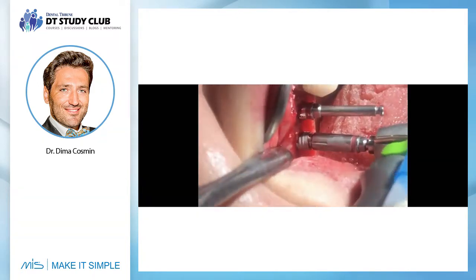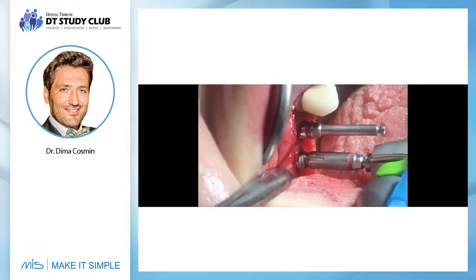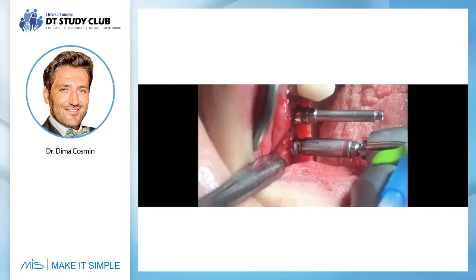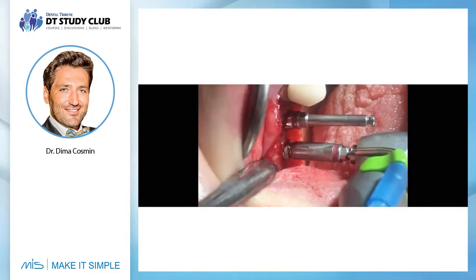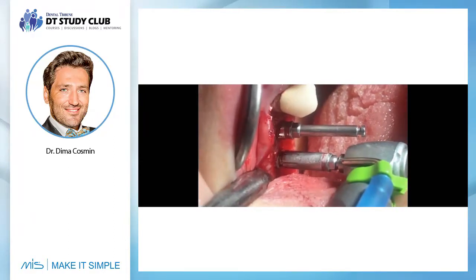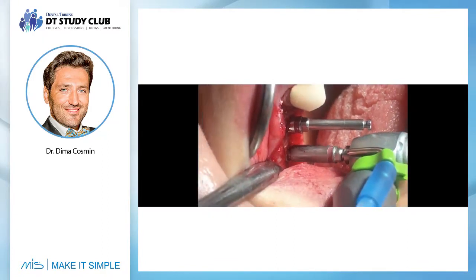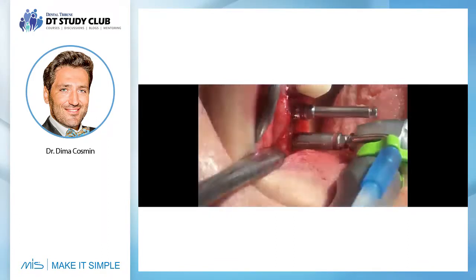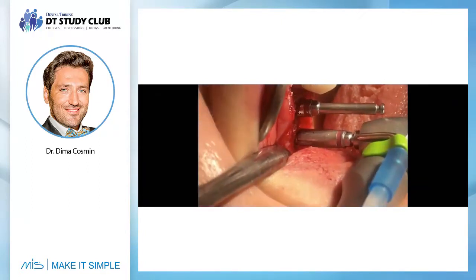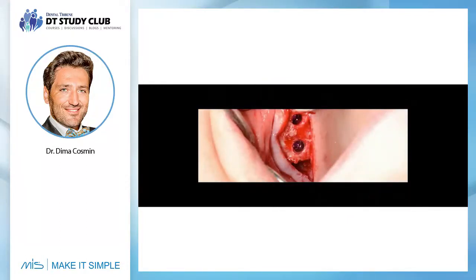The implant insertion is also very gentle, not too fast, not to compress the Schneiderian membrane too fast. Let time for the granules to go away from the implant way. And keep in mind the biological width and the bone remodelation.